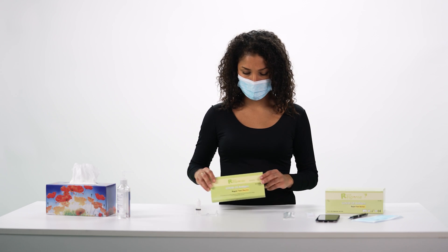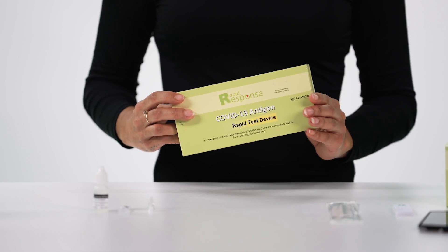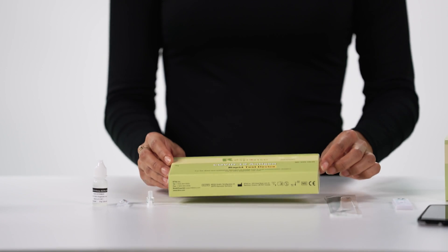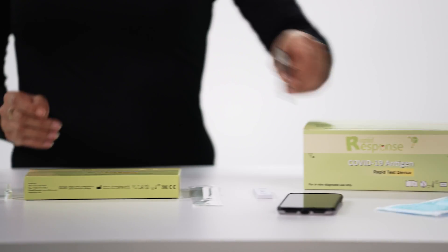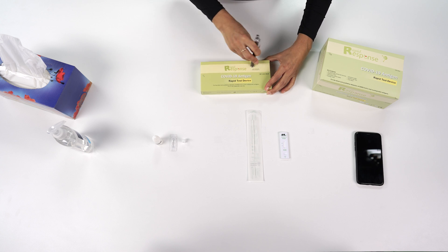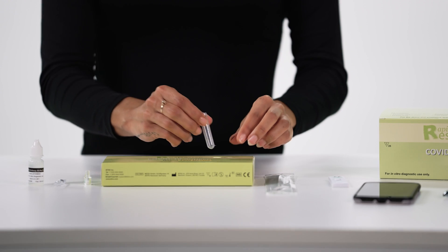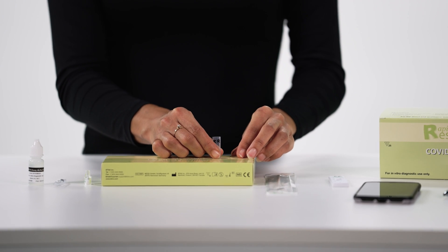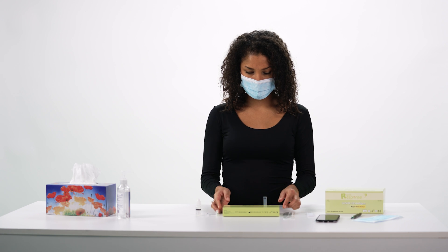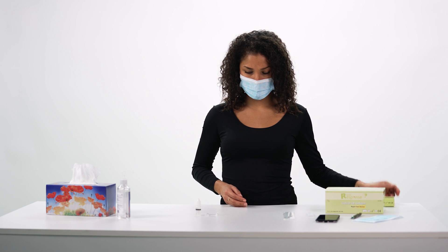Or, if you are using the 5-pack box as a tube stand, empty the box completely. Then use a pen to puncture one of the perforated holes on the front. Once the perforated hole is large enough, insert the extraction tube. The test procedure shown in the rest of the video is the same for those using the tube stand and those using the kit box.